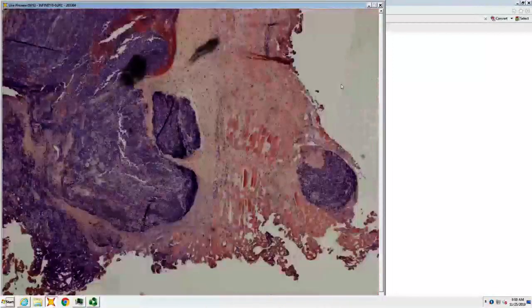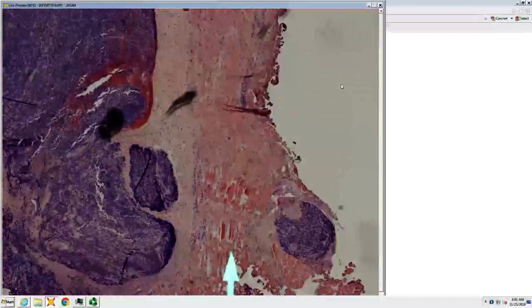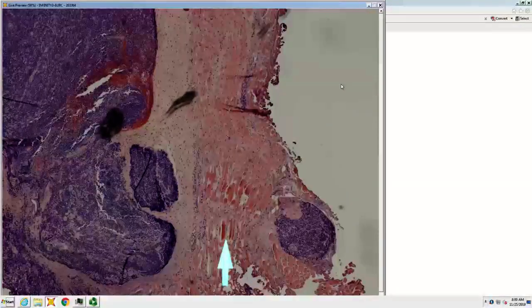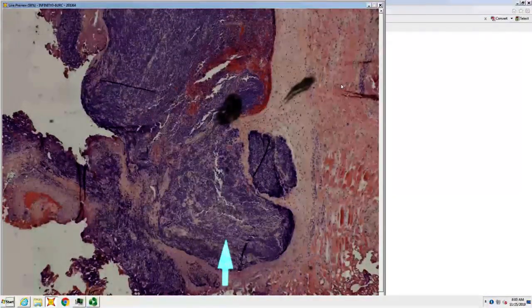Monomorphic infiltrate. I can't tell if they're like... So first off, where do you think you are? Probably mucosal. Is that face? It's muscle. So it's striated muscle, so somewhere head and neck, right? And then a fairly monomorphous lymphoid infiltrate.